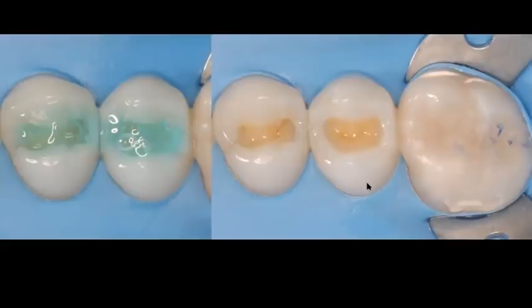In this particular case, we're going to use a universal single bottle dental adhesive, and we're going to saturate our preparations with the adhesive. Once you've saturated the dentin with the adhesive, you want to remove the excess of the dental adhesive. And I normally recommend removing the excess using a brand new micro brush.